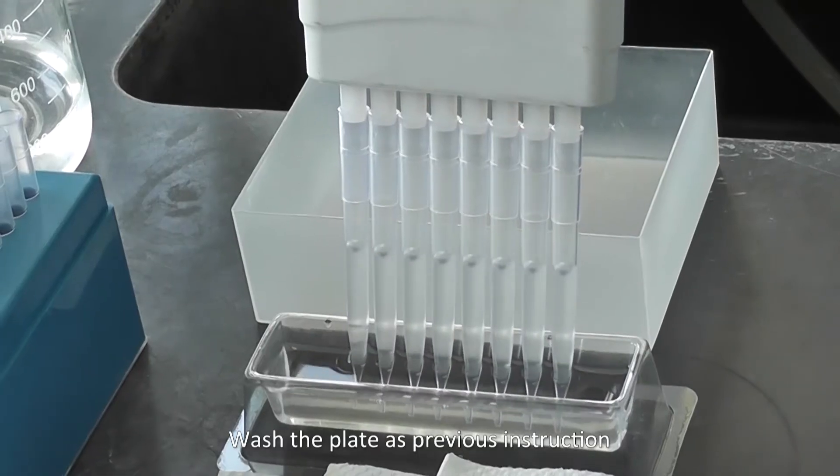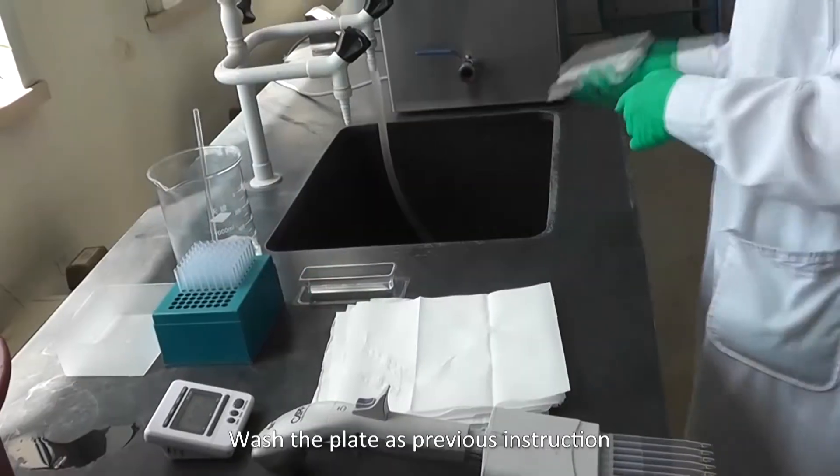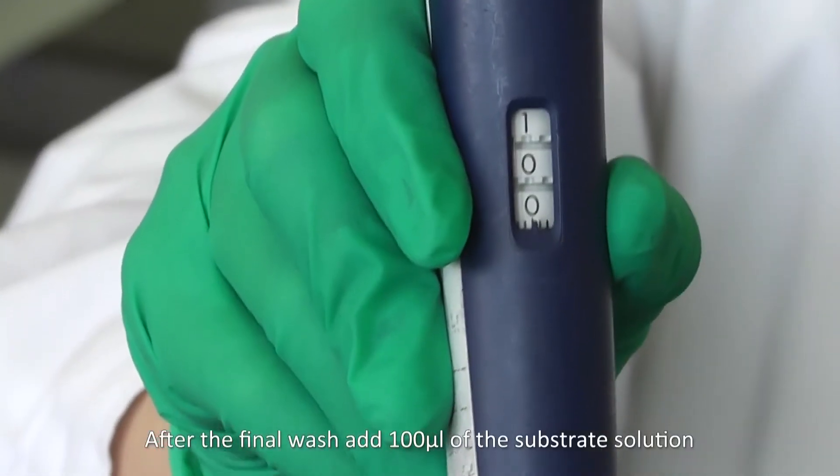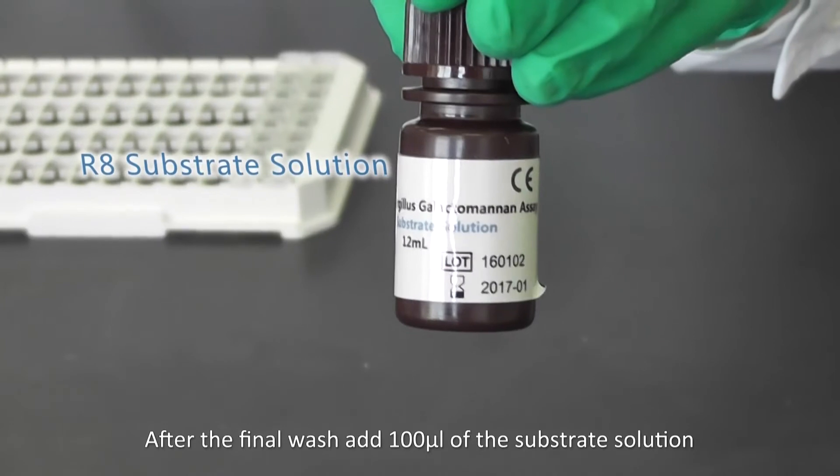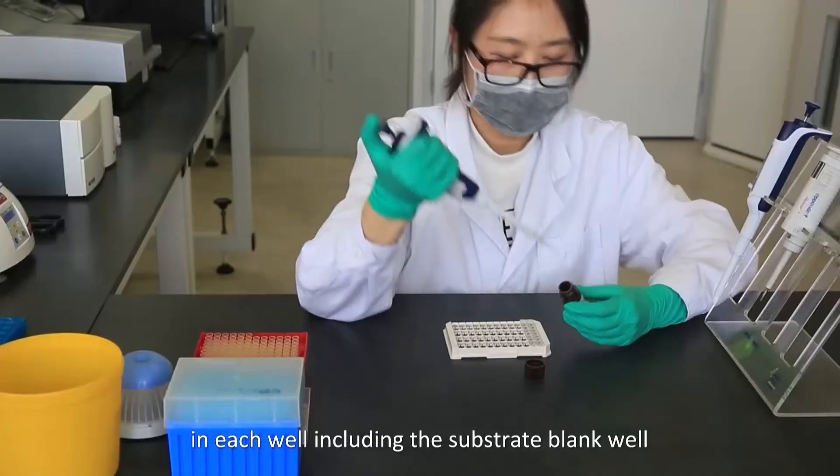Wash the plate as previous instruction. After the final wash, add 100 microliters of substrate solution in each well, including the substrate blank well.